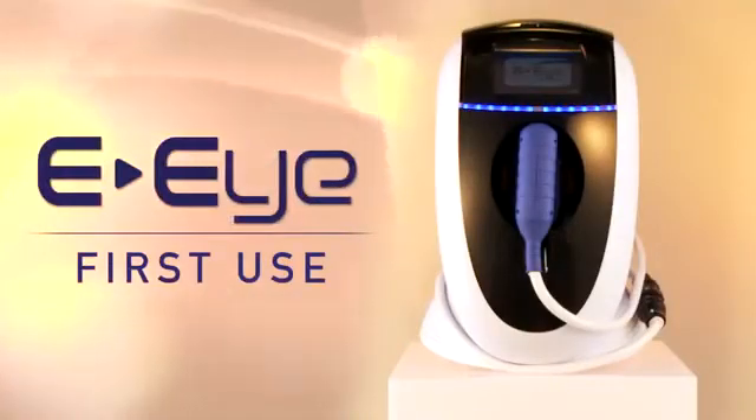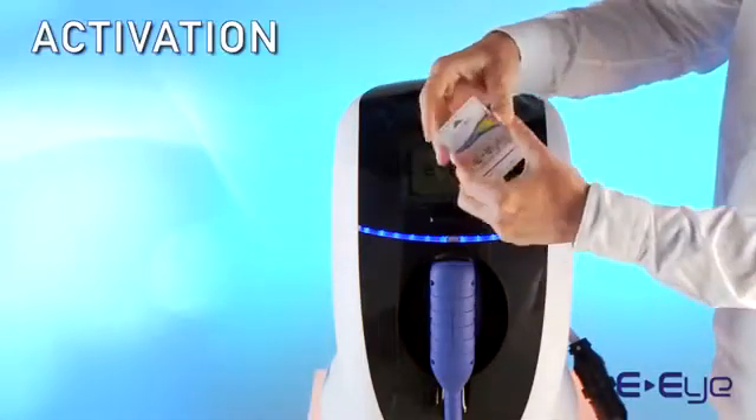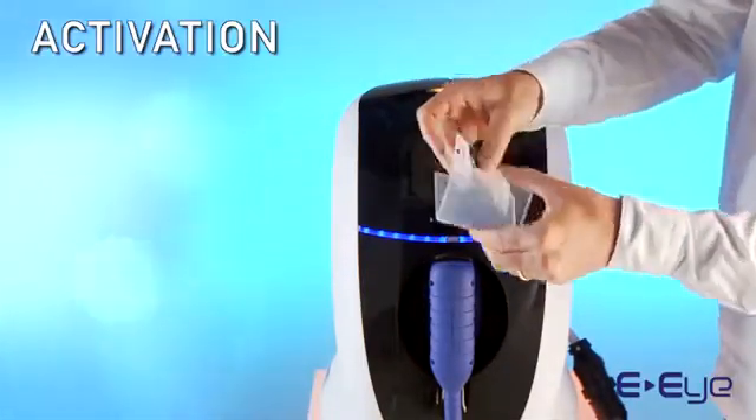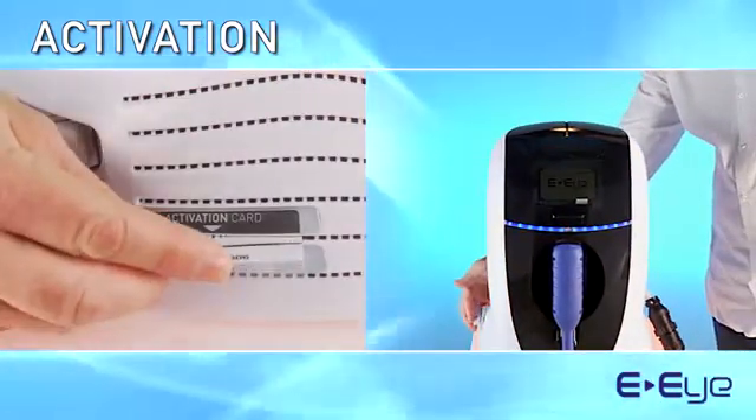Please take the following steps before using your EI. Insert the activation card supplied with your device. This card is specific to the cartridge with which it has been ordered.